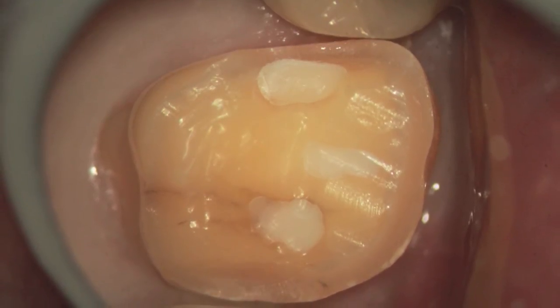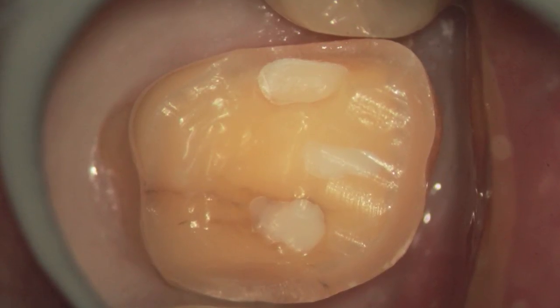It should last for a long, long time. You can see also the little crack there going from lingual to buccal. So here we go.